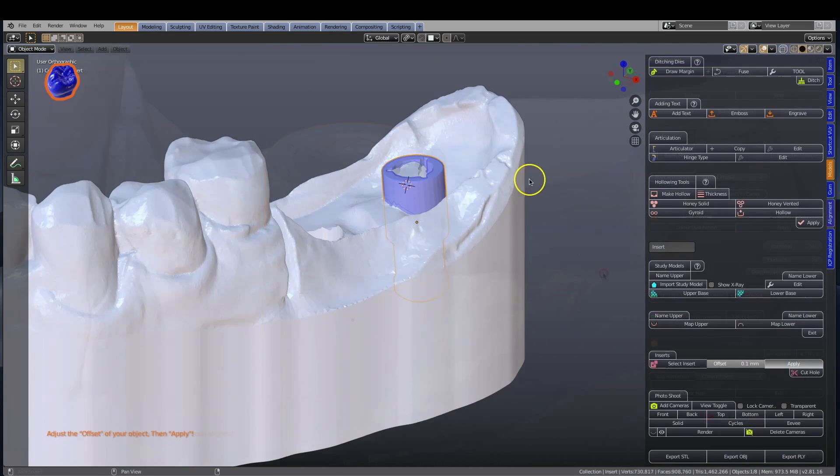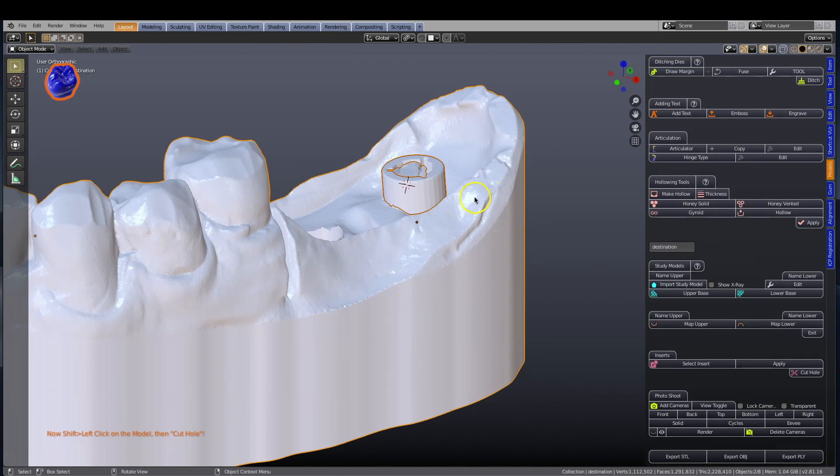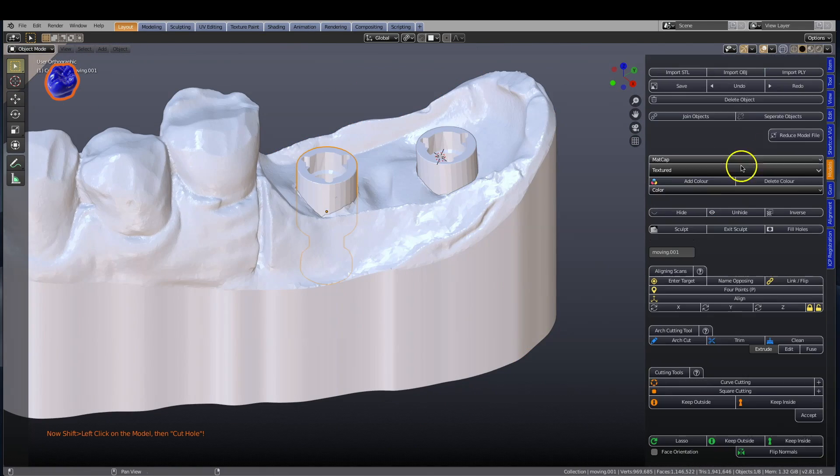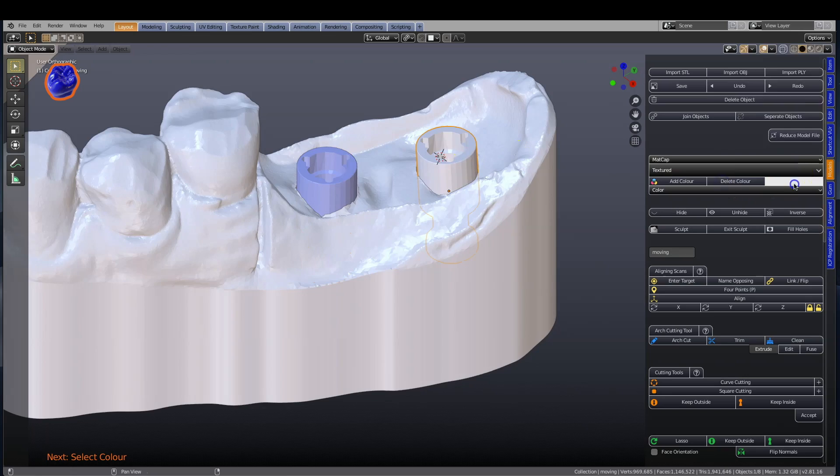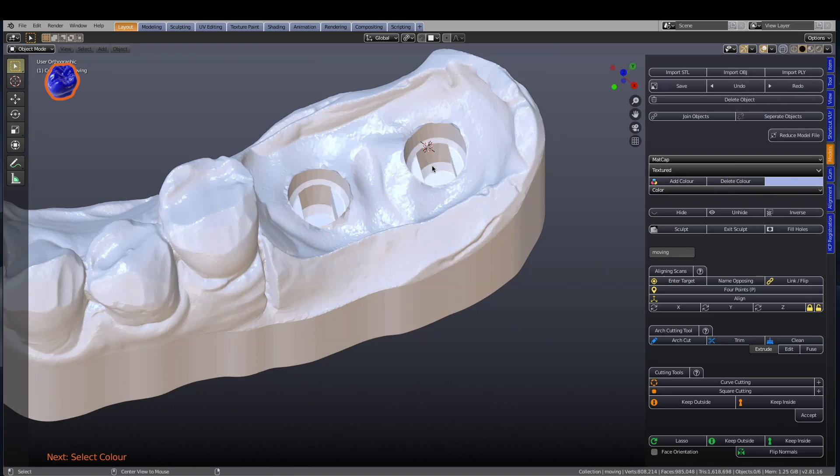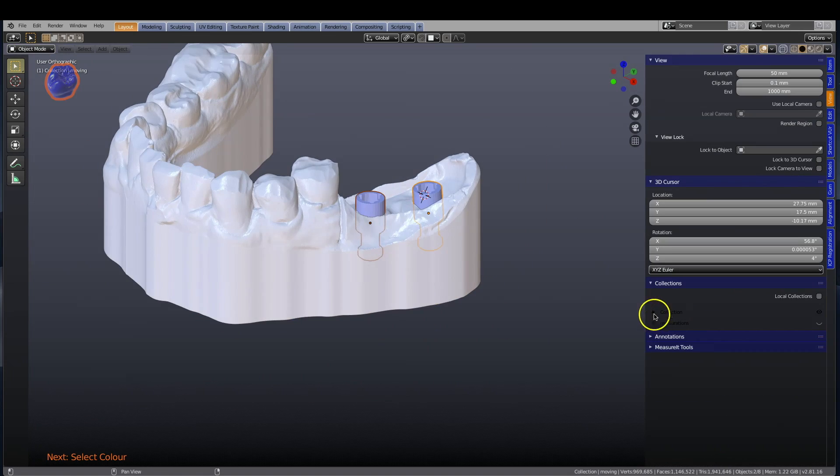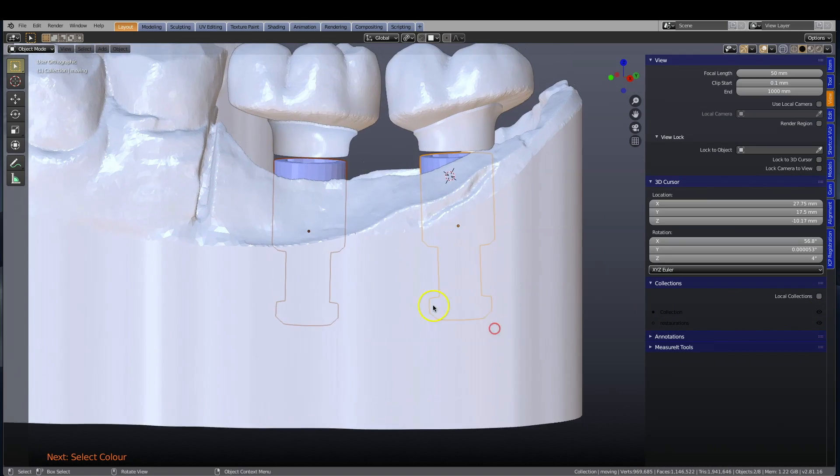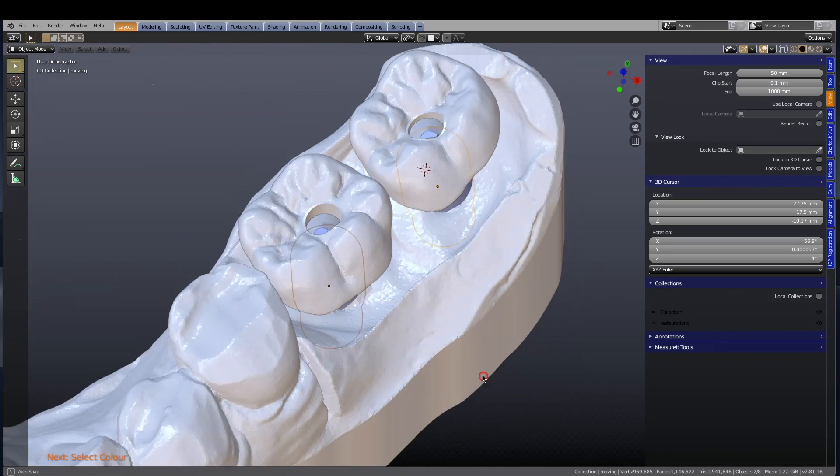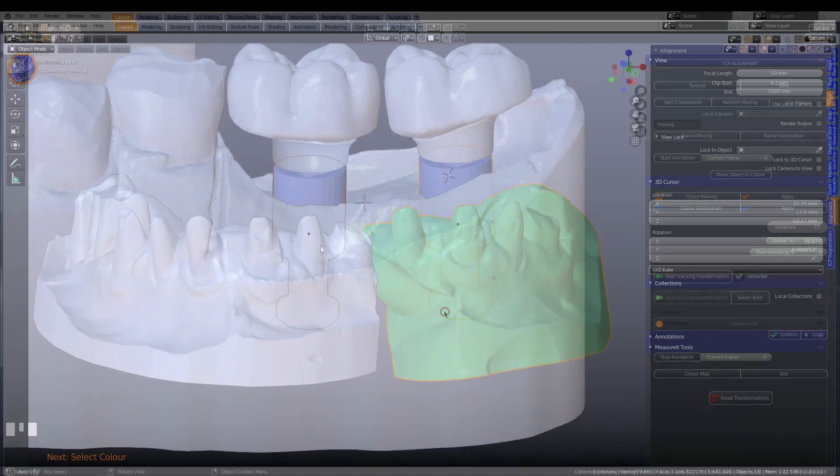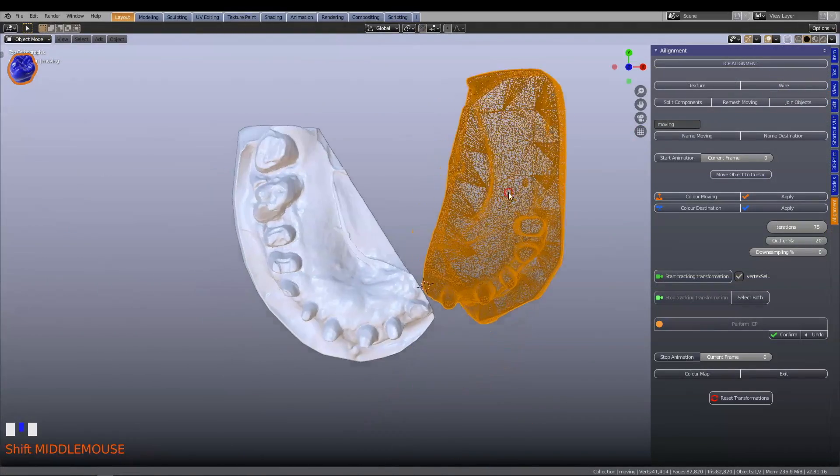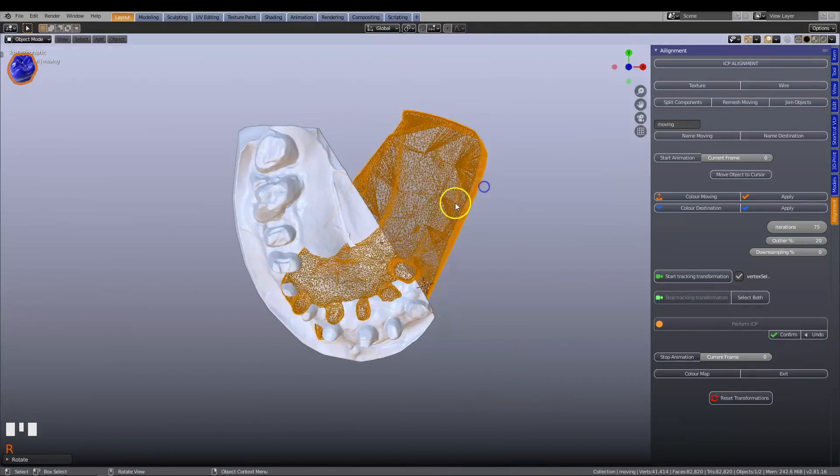With the ICP alignment tool, you can align implant scan bodies to make implant models. Two sectional scans can be easily fused together to form one model.